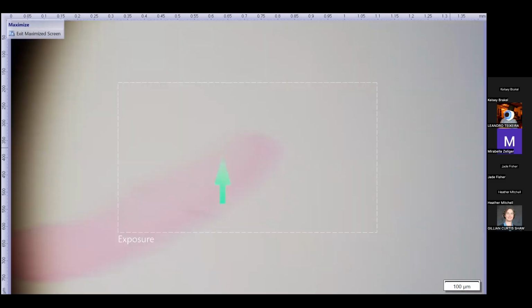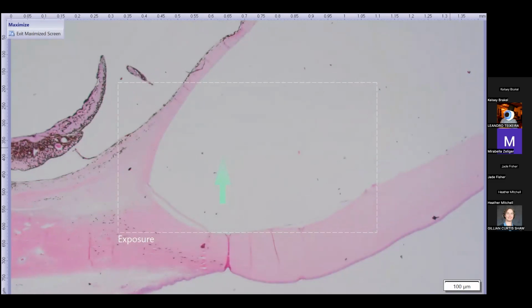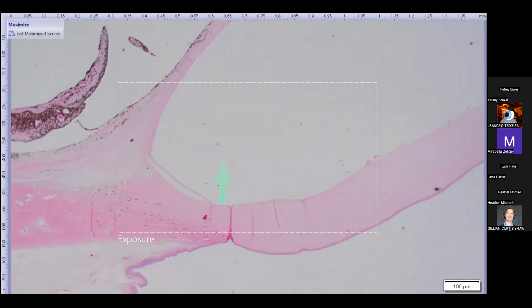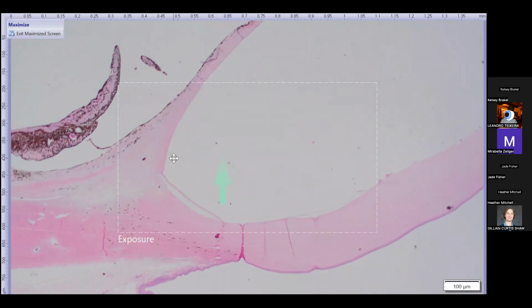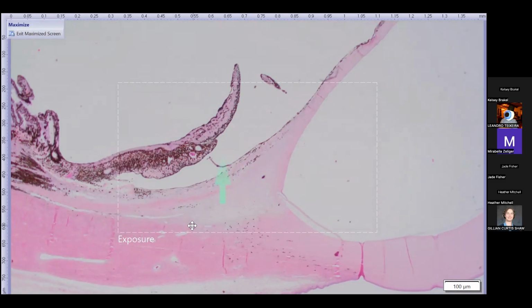Closer look. So one of the really interesting things about this case, we've got cornea up here. So there's that, but there's more pink tissue right here. Let's go a little bit further back to help illustrate what we're seeing. So this is a better view of basically the distortion I was kind of trying to point out on the gross. We've got this dense collagenous tissue coming in here. It crosses the anterior chamber. It dissects into the supraciliary space here.